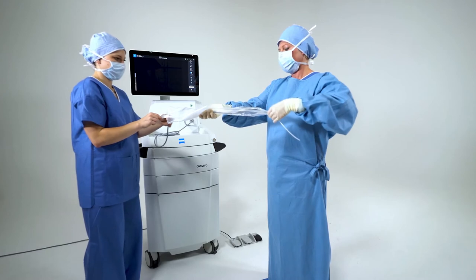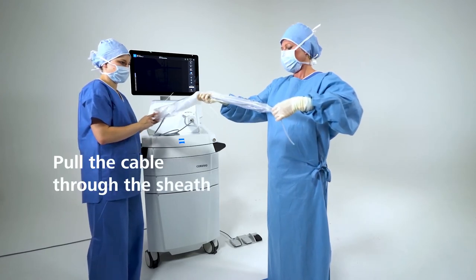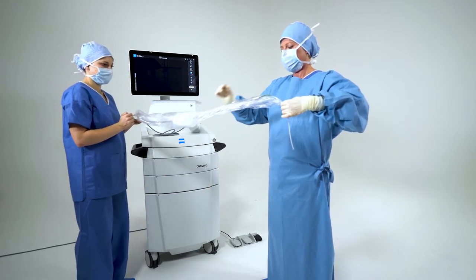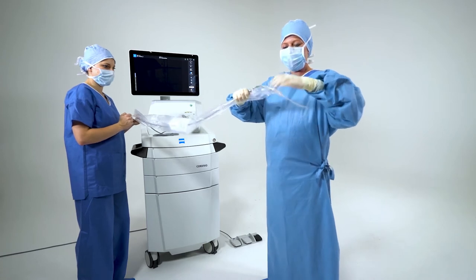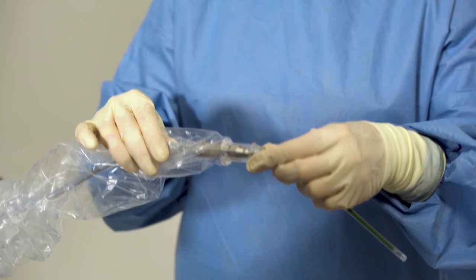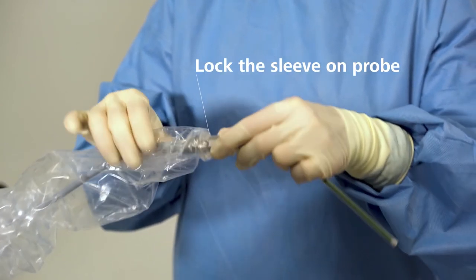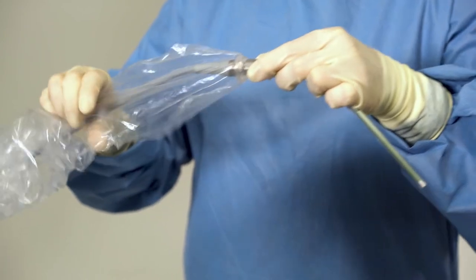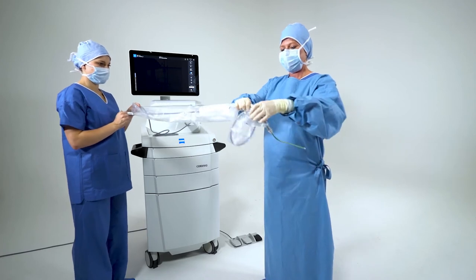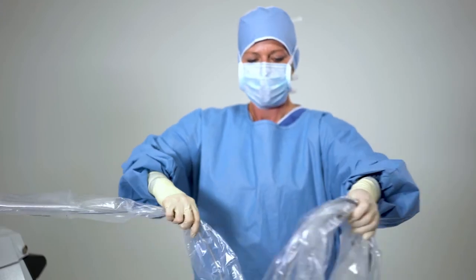Now the non-sterile nurse takes the two pull-off tabs and pulls the telescopically folded sterile sleeve over the cable until the desired length is reached. Check if the hand grip of the probe is snapped into the tube by holding the sleeve with one hand and pushing the scanner probe into the sleeve with the other hand until the locking ring of the sleeve engages audibly and noticeably on the handle of the probe. Finally, carefully wind up the cable and place it on a sterile surface in the usual manner.